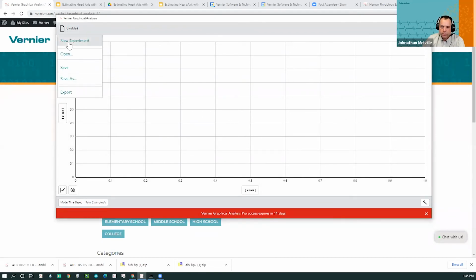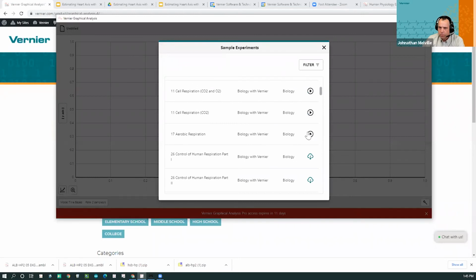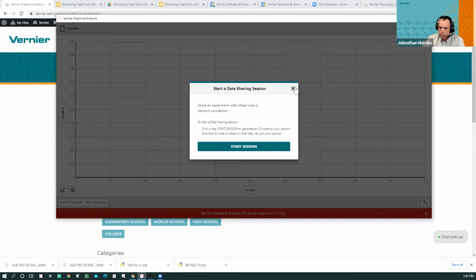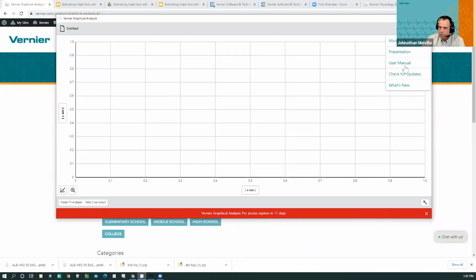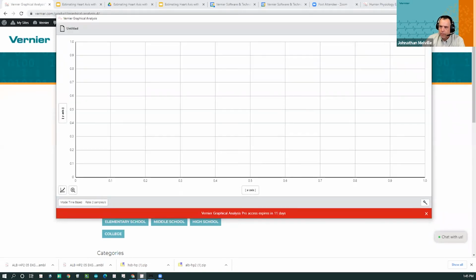There are videos that exist in GA Pro. Interesting. I'll have to see why that's not working. But what you can do is there are experiments that live in it. What's actually pretty interesting is if you have the Pro version, there is a way to insert video.